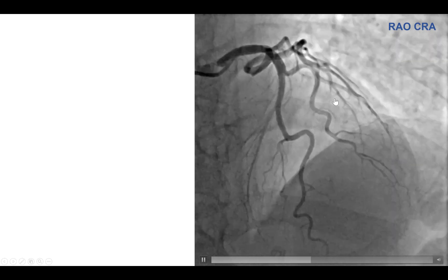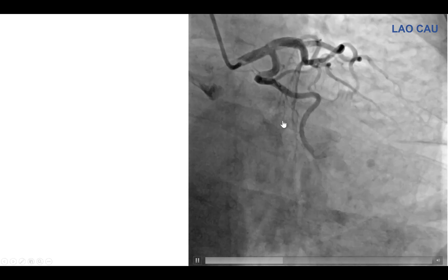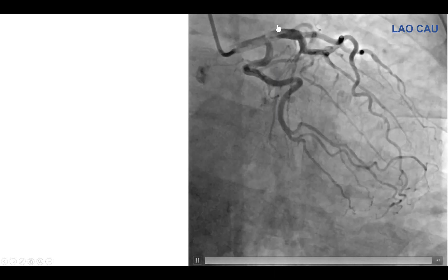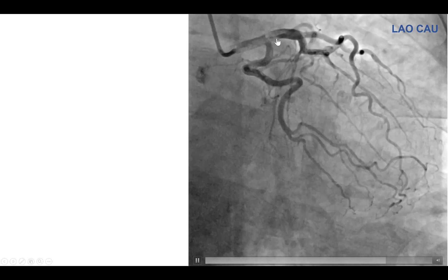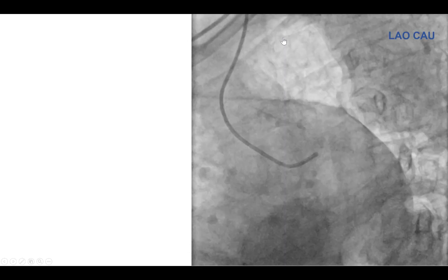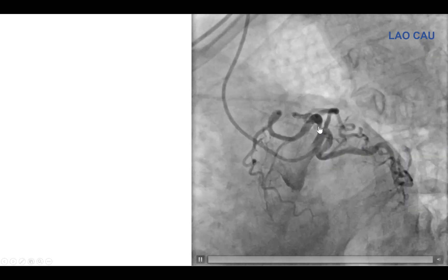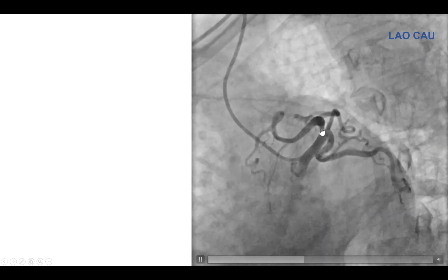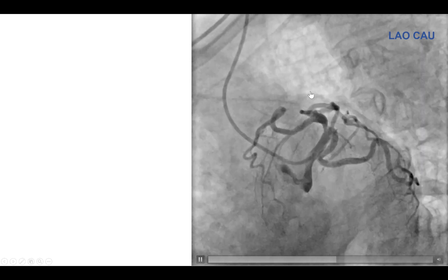Once again, the LAD seems to be free of significant disease, as is the large diagonal branch. Going to different views, there appears to be no significant disease in the circumflex. The proximal LAD is an area that might have something, but nothing is clearly significant at first view. Then in the spider view, there was indeed some stenosis in the ostium of the LAD, without significant disease in a tortuous circumflex or a ramus branch.